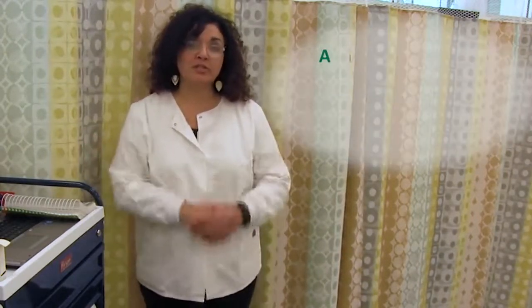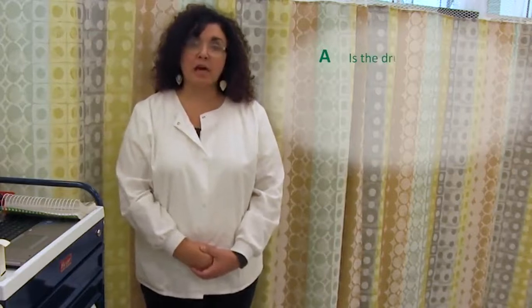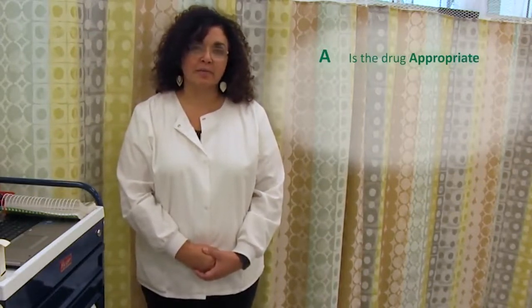Remember, when giving IV push, before we push, we must ACT. And ACT is an acronym for the things that you must check before giving the medication by this route. A: is it appropriate for the IV push route? In other words, can it be given undiluted? A: and is it in accordance with your agency policy? There is a lot of policy surrounding IV push in the hospital setting.